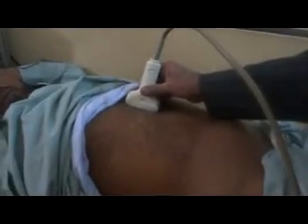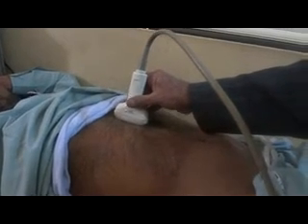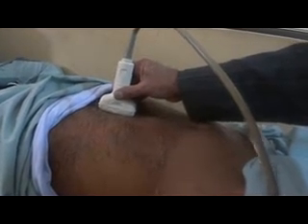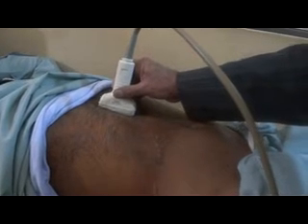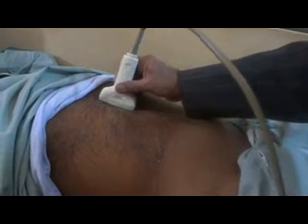This is a video segment of a very interesting pathology which you see very rarely. I have placed the probe longitudinally in the epigastric region just below the xiphoid process, and I'm angling and maneuvering it because my target is to view the portal vein.